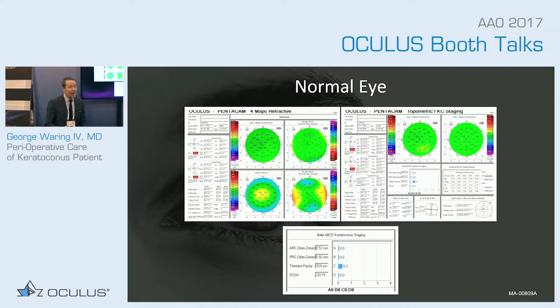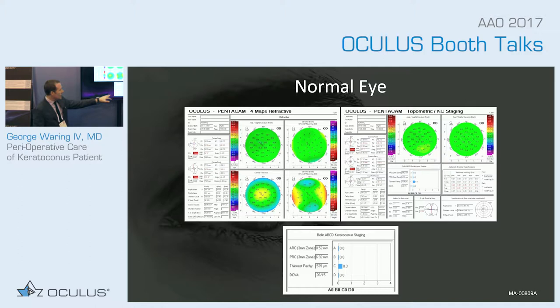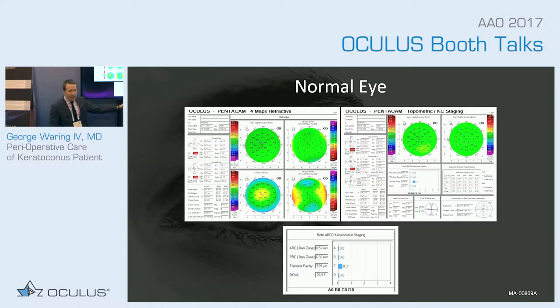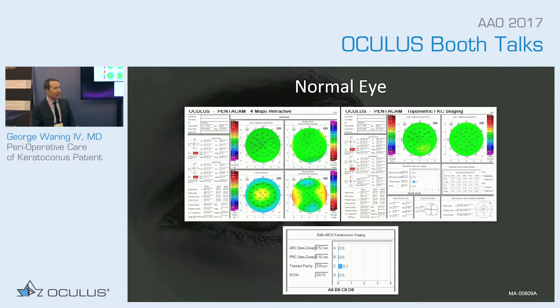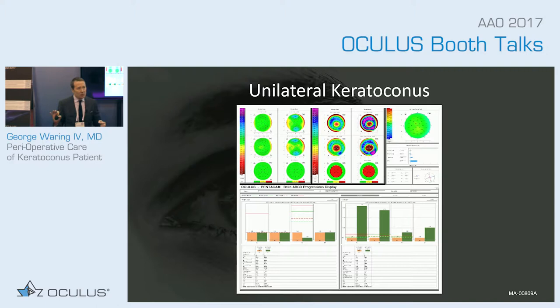Here's a normal eye looking at the Belin ABCD keratoconus staging. Looking at the 3mm zone we can look at our thinnest pachymetry, and if we input distance-corrected acuity via our technical staff, we get a beautiful graph showing keratoconus staging based on Dr. Belin's ABCD criterion. This shows that across the board, ABCD scores of zero tell us this is likely a normal eye.